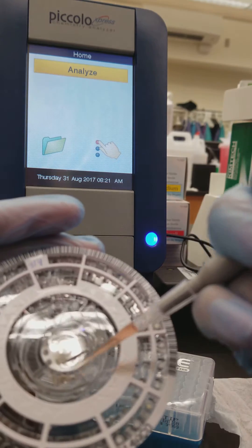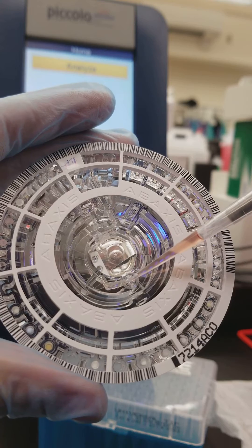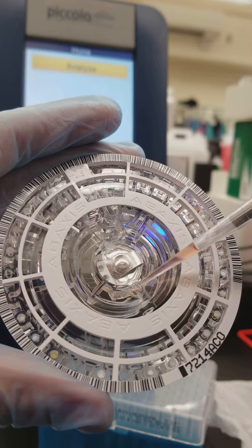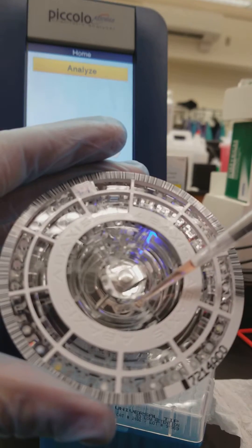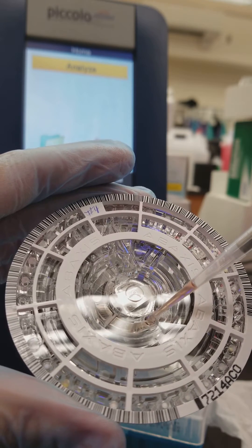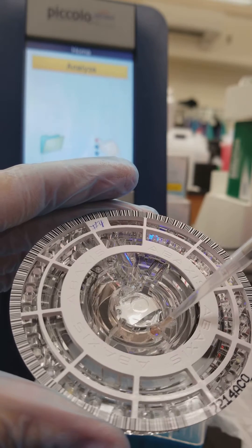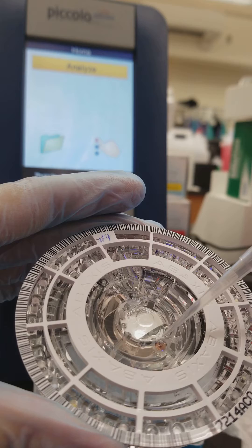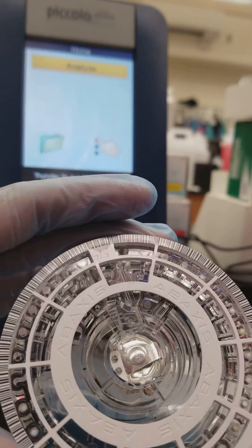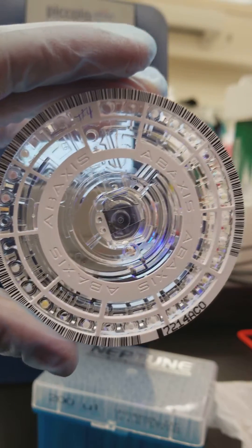I'm filling now. I'm tilting — it's not focusing very well. So we have reached the fill line. It's completely full to the fill line.